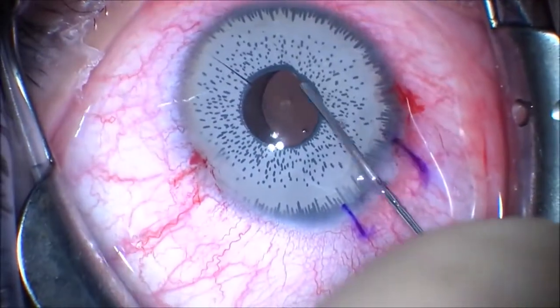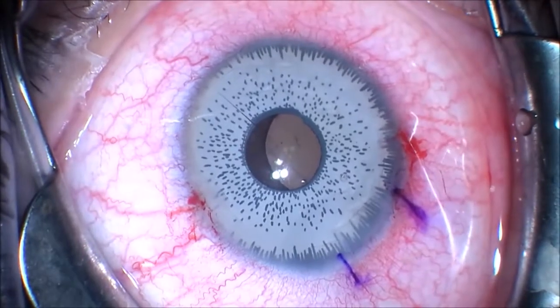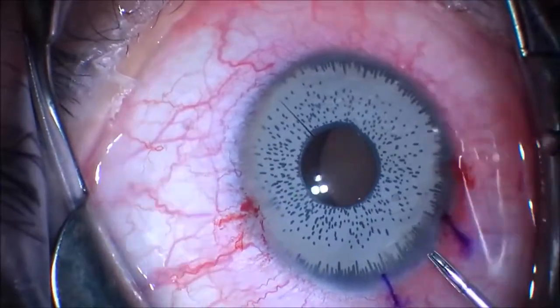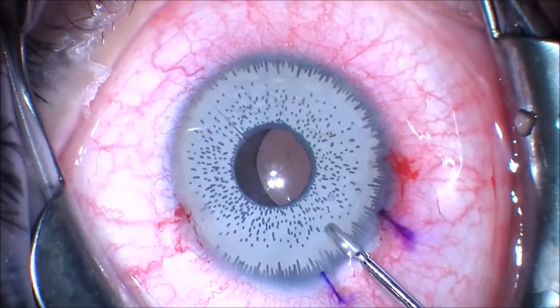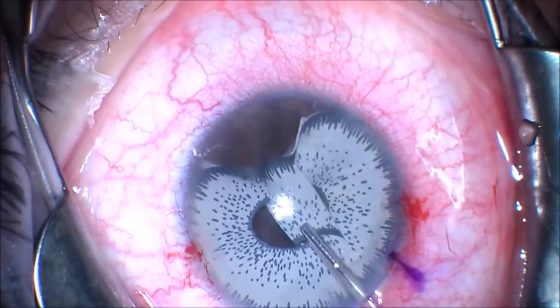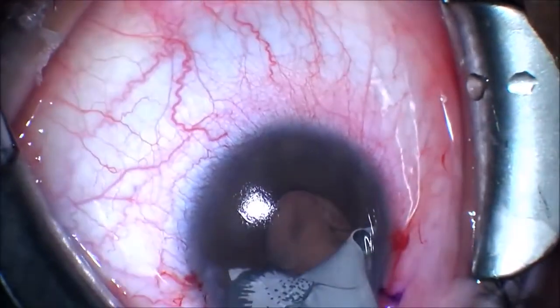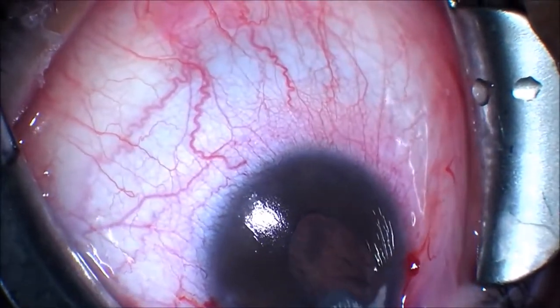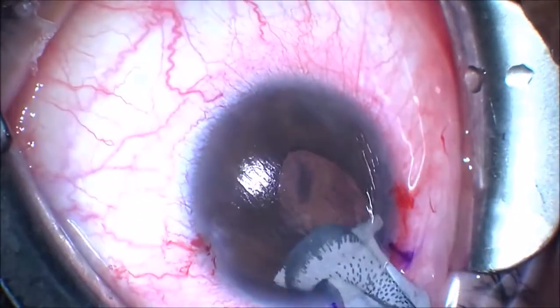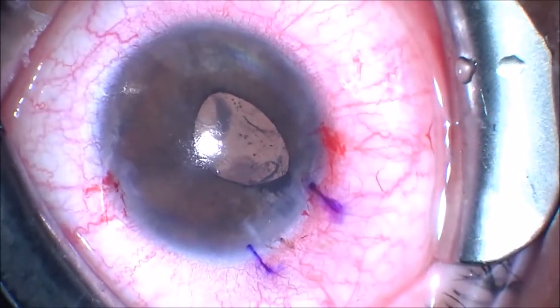We're going to use a pair of micro grabbers to grab that tab, and this should allow the iris implant to fold over on itself, and we can remove this iris implant through the 4 millimeter enlarged clear cornea incision. You can see that the iris implant is turning and being removed out of the clear cornea incision. The tab dislocated at this point, and we use a microforceps to remove the rest of the iris implant.